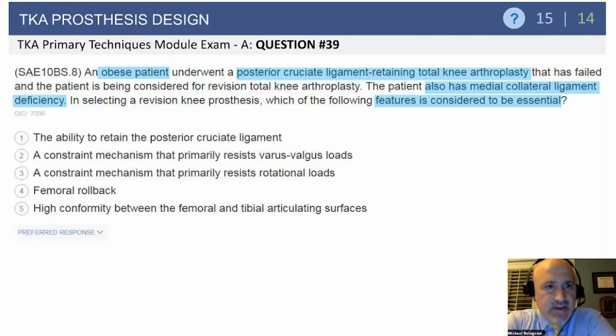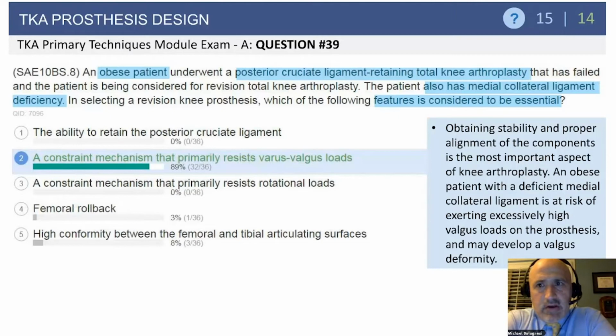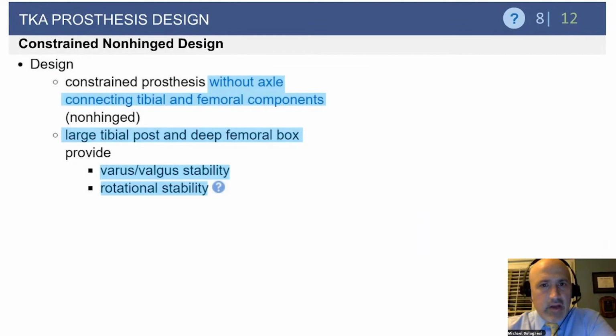They're posing ability to retain PCL. The next one, constraint mechanism, resist varus valgus loads. Something that resists rotational loads, something that allows femoral rollback, and then high conformity is discussed. What you really want to be concerned about with the MCL out is a constraint mechanism that resists varus valgus loads. You've got to have something that's going to replace the deficient MCL, and that's critical in that type of case.